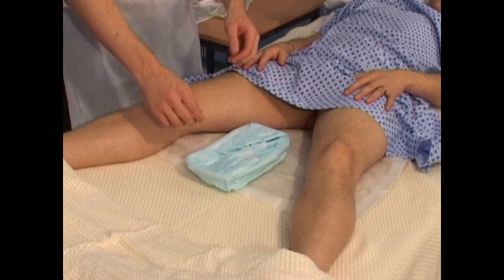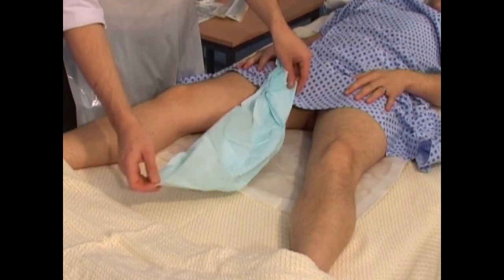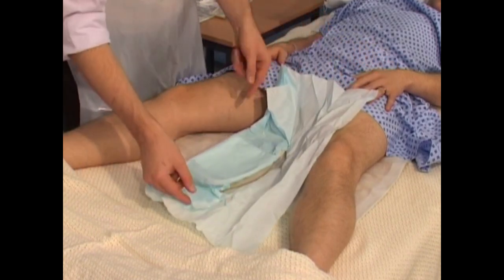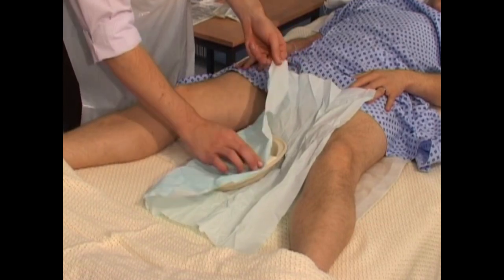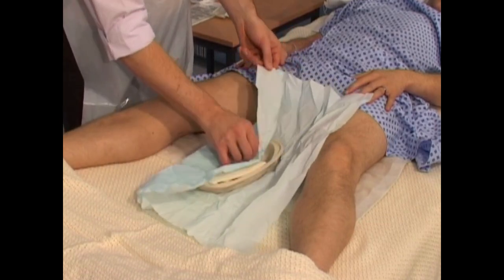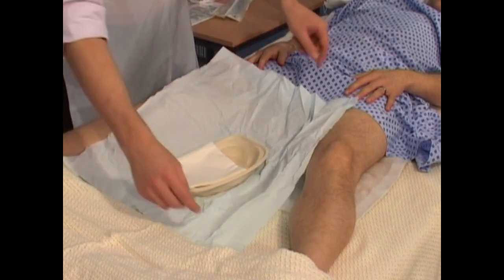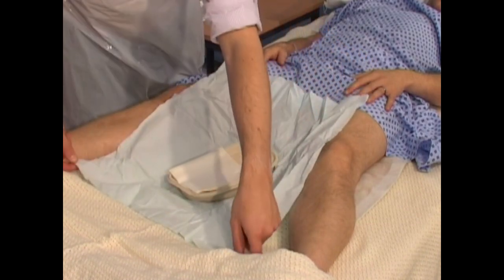Remove the catheter pack from its wrapping. The catheter pack should be opened carefully, only touching the outside cover of the pack. Avoid touching the inside sterile part of the packaging. You may wish to create this sterile field either between the patient's legs or on a nearby mobile trolley.